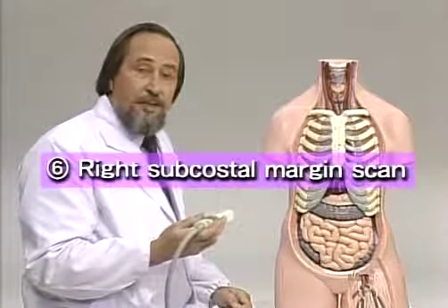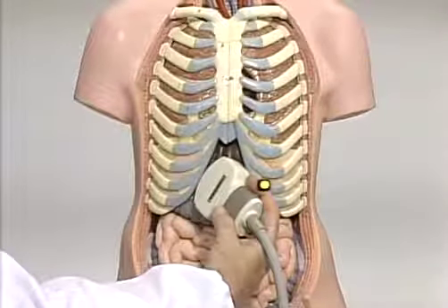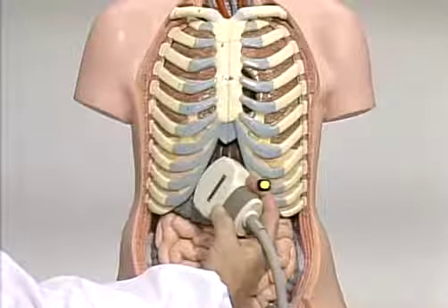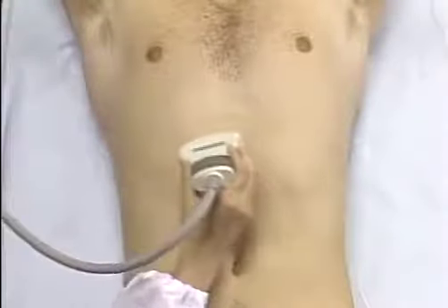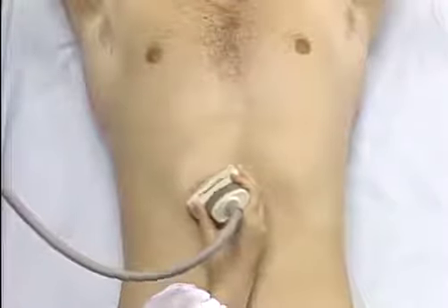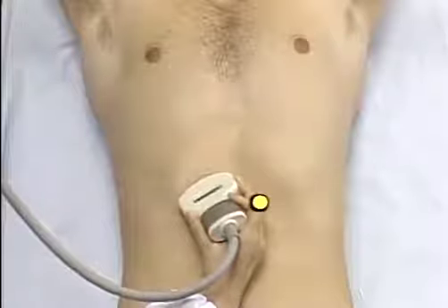Next is the right subcostal margin scan. Use this procedure to observe the right hepatic lobe, gallbladder, bile duct, and right kidney. Scan by slowly sliding the probe along the costal margin and tilting it. Repeat the motion several times.